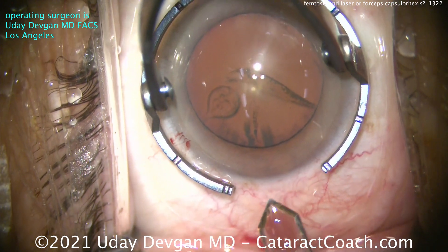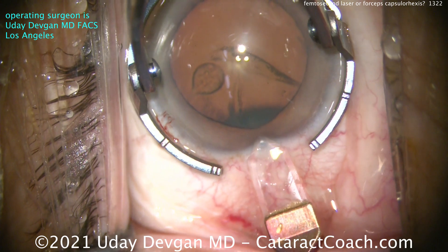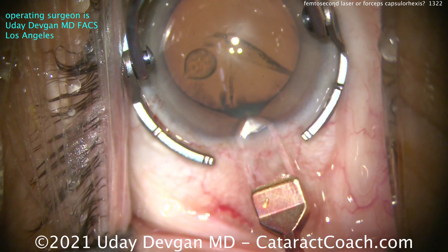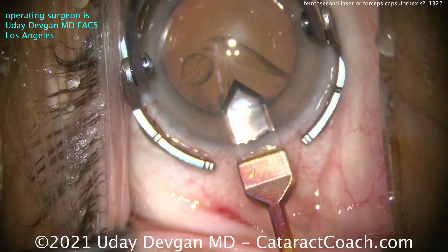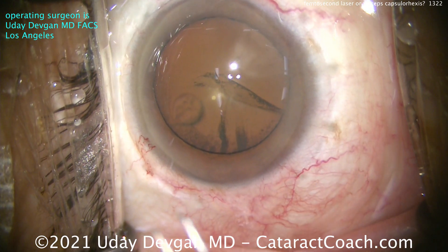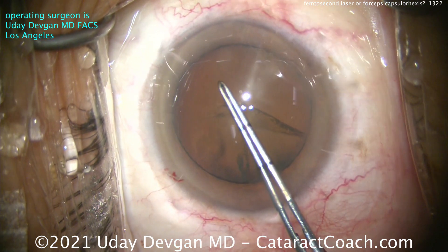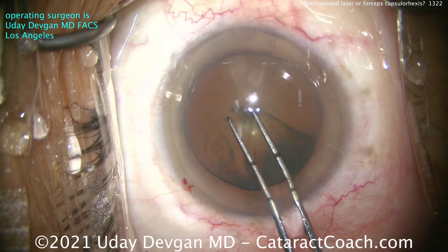Let me show you a case first with the forceps. I'm using a diamond keratome to make that main incision. The diamond keratome makes a much better incision than the femtosecond laser — yes, it's true. You're better off with a diamond than you are with the laser. There's no question about that one. Here comes a capsulorrhexis.